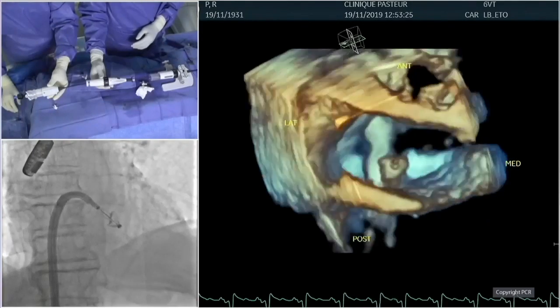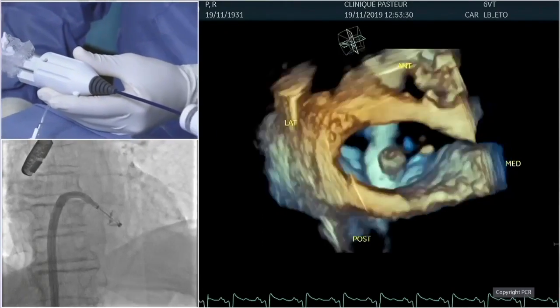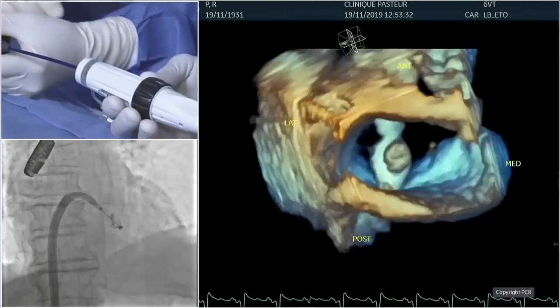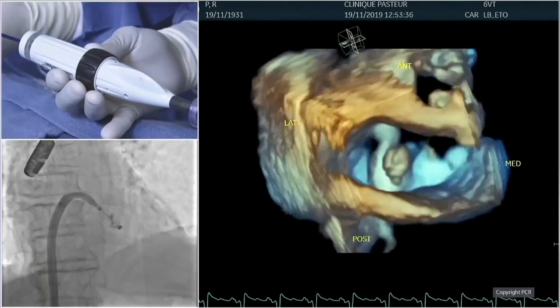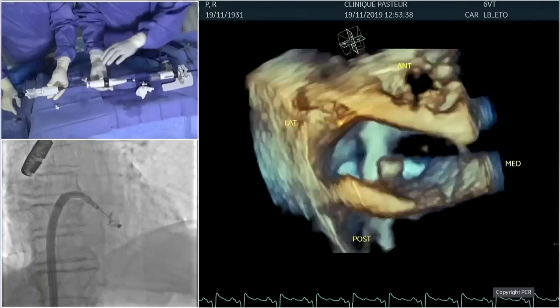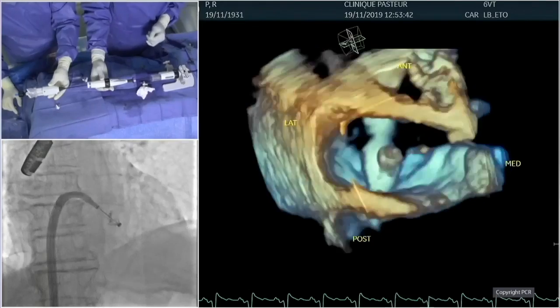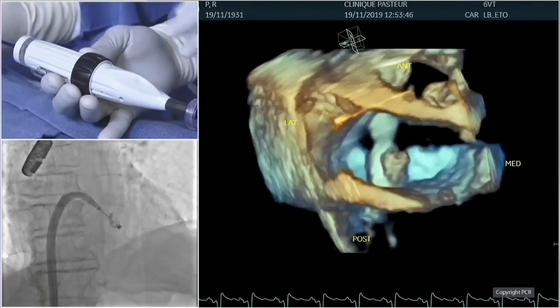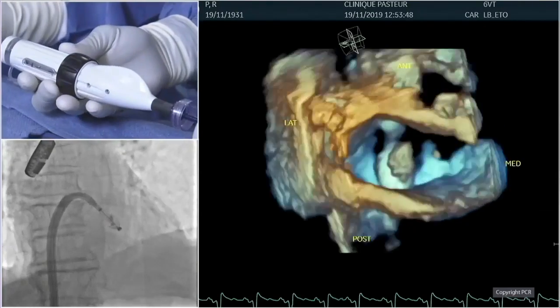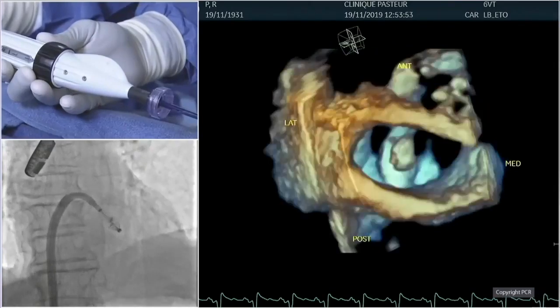Yeah, you're right. We will change that after. Yeah, you're right. We have to correct and go more anterior. So Didier is currently doing that. Yeah, rotating. And it was even a feature that was necessary, because as Nicolas was rotating clockwise, just to allow that clockwise rotation to reach the tip of the steerable and to be applied to the IC, I had to correct a little bit counterclockwise. So maybe I'm already moving a little bit more anterior, but we're going to see it better on the X-plane view. Okay.